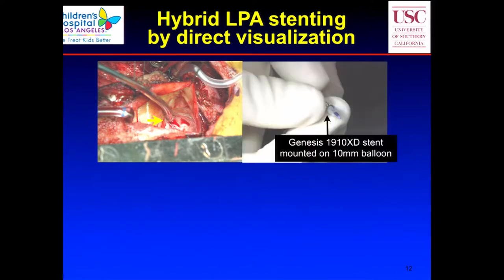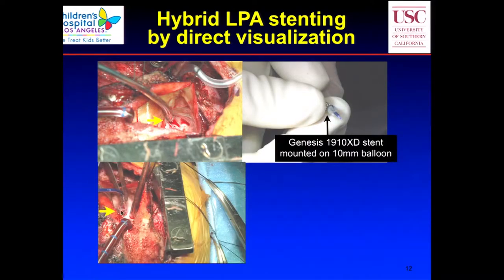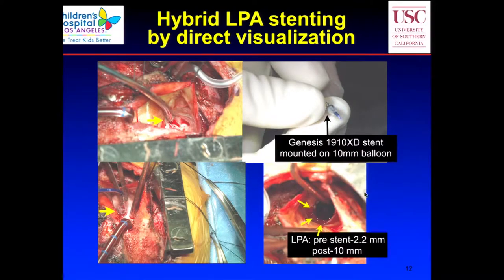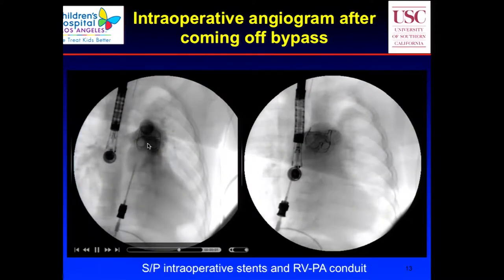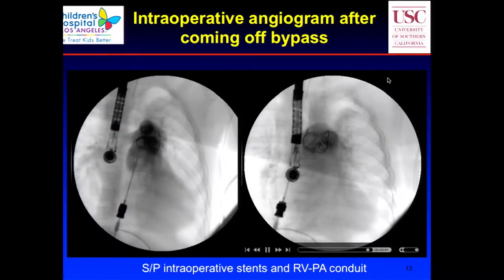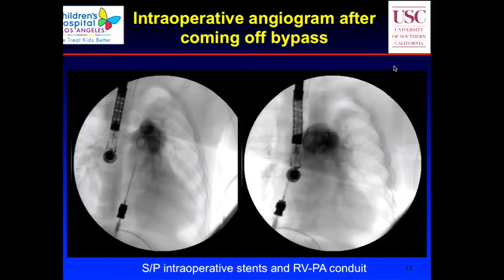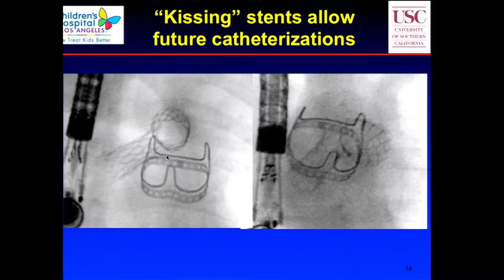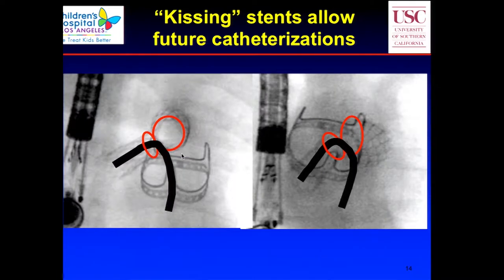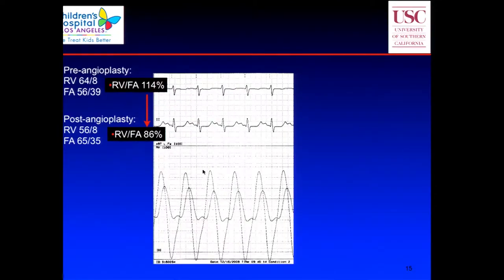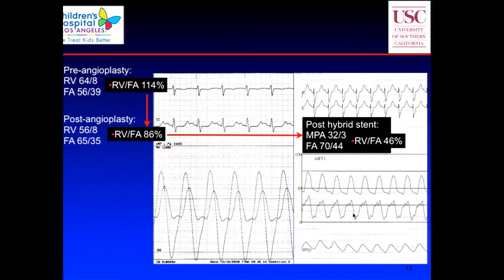It's important not to do too much dissection because you can cause rupture — we ask surgeons to minimize dissection so the scar tissue remains part of the wall. Then we go to the other side: the orifice is visible, the stent is mounted on a balloon, and we position the balloon with the stent edge precisely placed. The surgeons also put in a new conduit due to regurgitation. We can then put a needle in and do an intraoperative angiogram. We positioned the stents so both orifices remain open — two touching orifices accessible for future catheter interventions. RV pressure dropped from the initial measurement down to 46% systemic, confirming effective treatment.